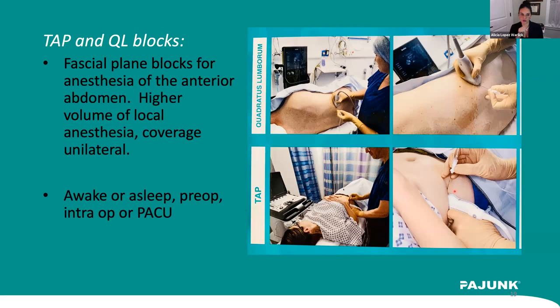The advantage to doing the blocks in the pre-op area is that you avoid the perception of delay in the operating room. Sometimes, as you guys probably experience too, and tell me in the chat if this happens to you, when you decide to do a block in the operating room, something goes wrong or there's a delay, and then you're getting your ultrasound set up, and the surgeon is frustrated or tapping their foot because there's a perception of you delaying the case. I think that's unnerving, and sometimes I don't like to deal with that. So I do it in the pre-op area if I can.